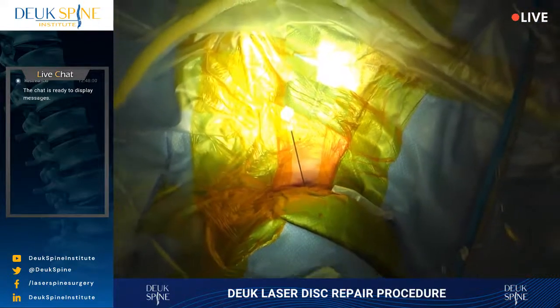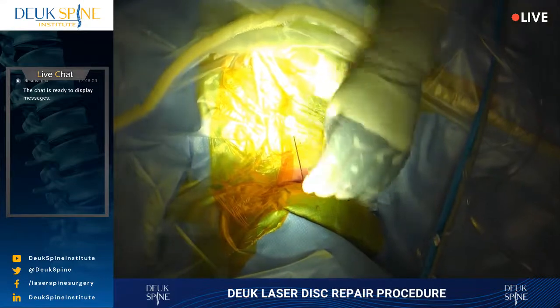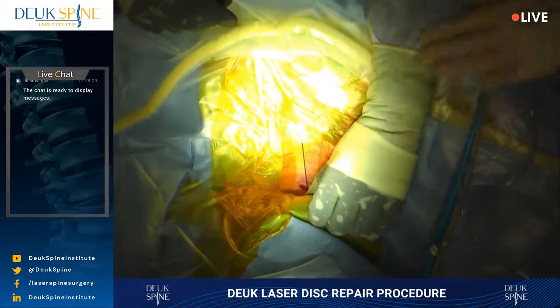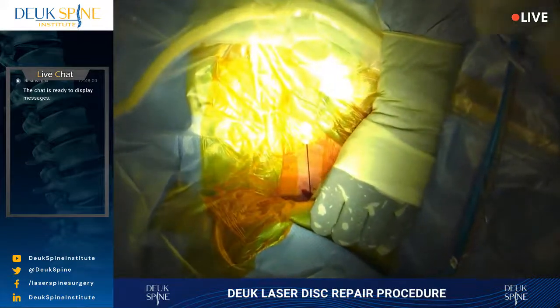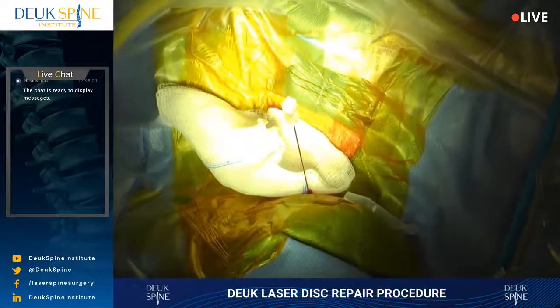So now we're going to do our discogram. Our patient is not awake. Can we just make sure blood pressure is good? Let me have the Ray Tech. We didn't do any local yet, right? Let me do some local first.